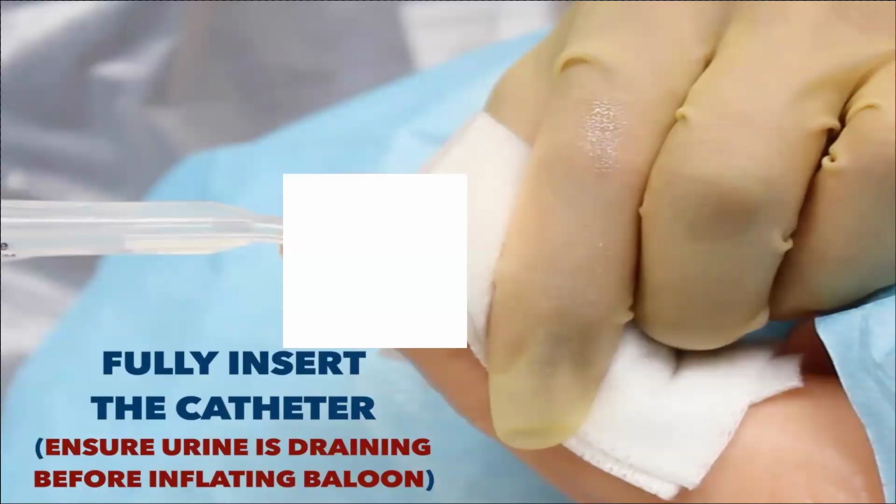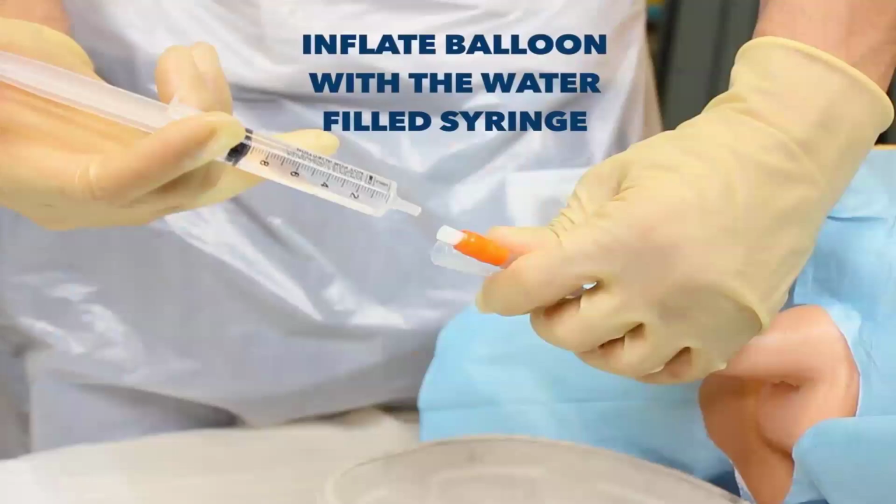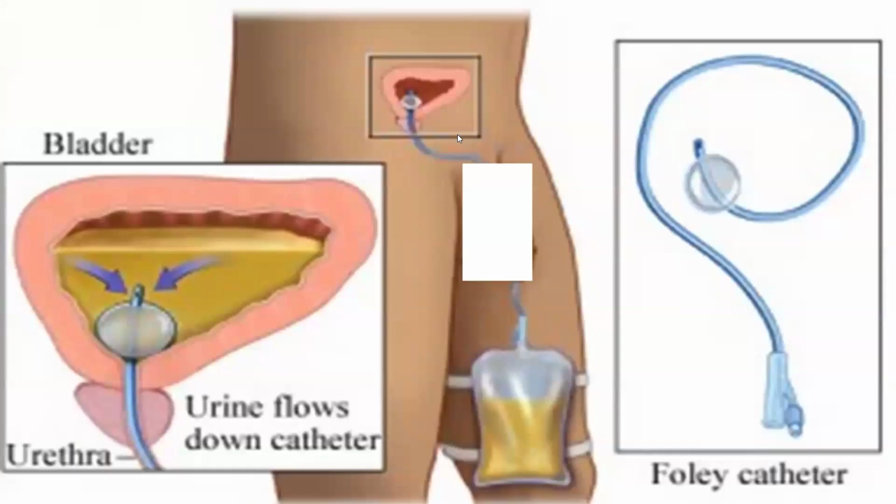So you inflate the balloon. Again, sometimes they come with prepackaged solution, sterile water, which you use to fill the ports, the designated ports, which usually are colored. So once you've done that, you connect the catheter to the urine bag and then you pull it out. You pull on the catheter so that the inflated balloon rests on the bladder outlet.